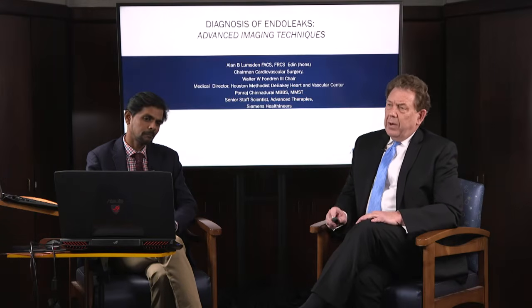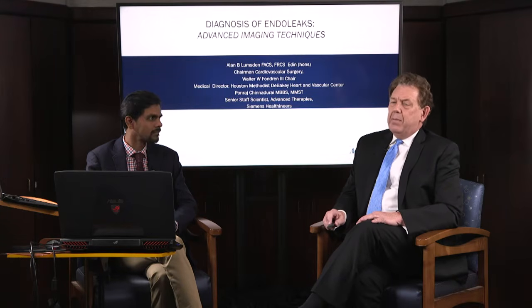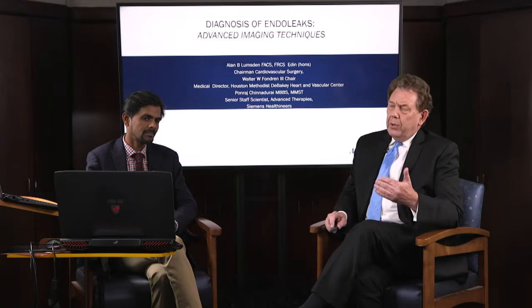Let me just start off by level setting a little bit of the background knowledge. We're going to talk about the diagnosis of endoleaks, not so much tonight about the therapy for endoleaks. That's something we plan to cover in a subsequent webcast. But we'll touch on it a little bit and kind of point to the importance of advanced imaging.